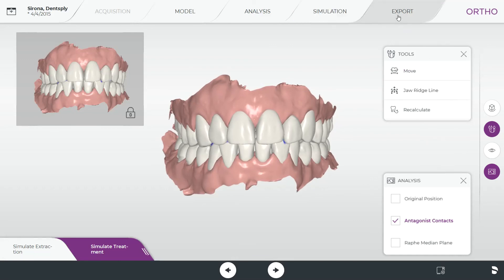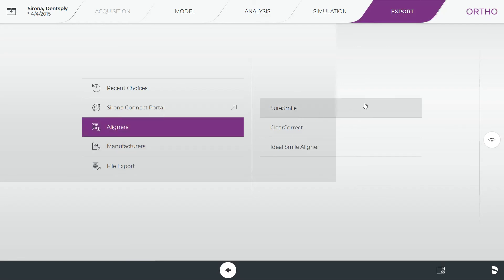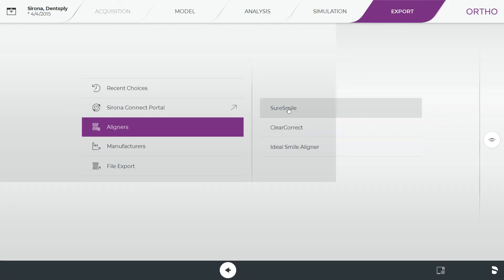On the Export tab, click Aligners to submit this scan with one click to SureSmile, Clear Correct, or Ideal Smile Aligners — SureSmile being the primary one. Click SureSmile, enter your password, and within a few minutes your scans will be over to SureSmile so you can do the prescription for this patient. I hope this helps — if you have any questions please feel free to reach out, and I hope you enjoy your experience with CEREC Ortho 2.0.